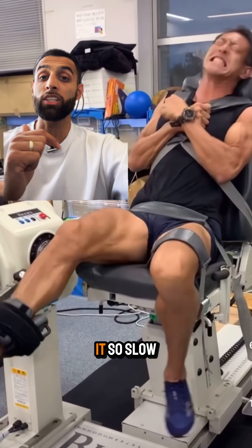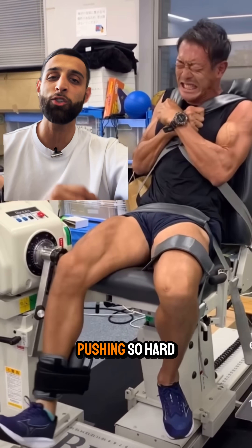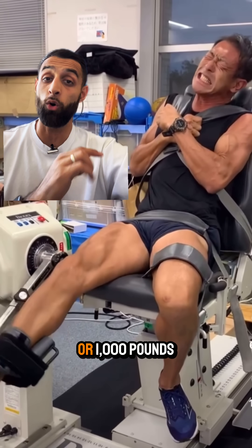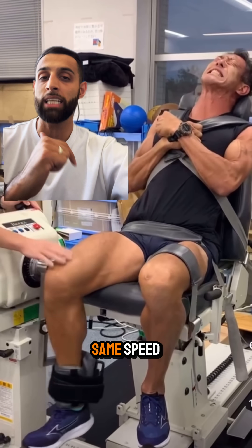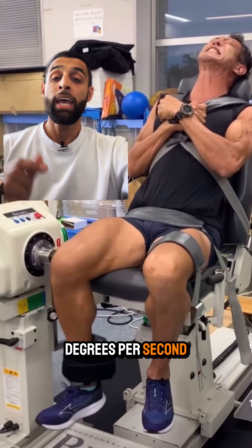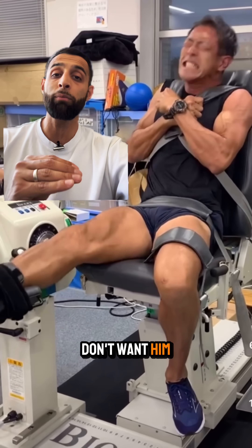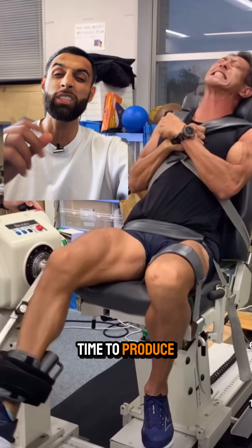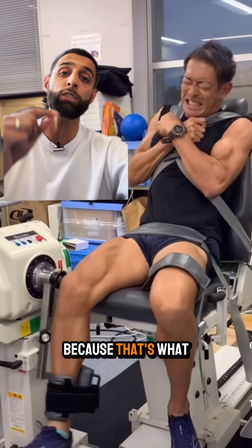The reason he's moving so slowly even though he's pushing hard is because the machine is designed to do that. Whether he pushes one pound of force or a thousand pounds, it's going to move at the same speed. This setting is around 60 degrees per second. We use it because we don't want him to overpower the machine — we want to give his body time to produce its highest amounts of force, because that's what we're measuring.